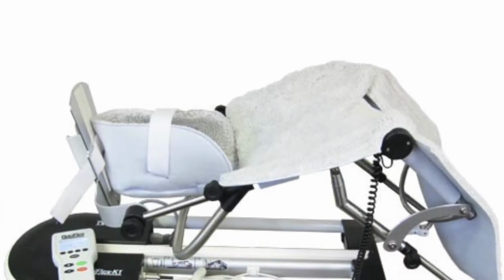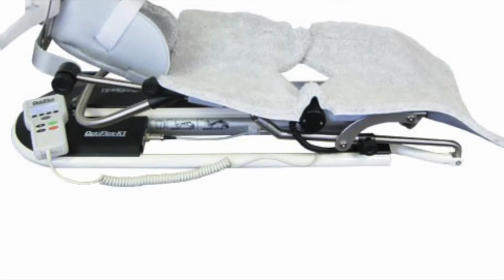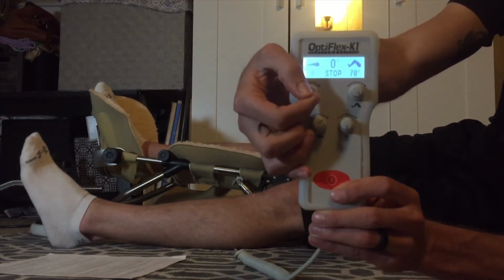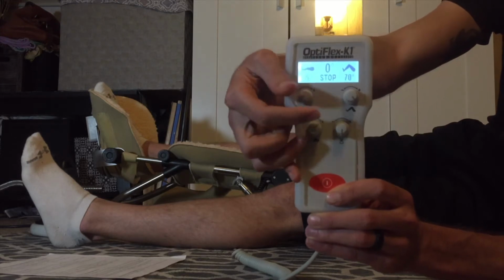This is a CPM device, or continuous passive motion device, for the knee. This is the Optiflex K1, the one that I used. I had the classic remote, the one with these dials here. And so what these dials do is these top two adjust the angle.